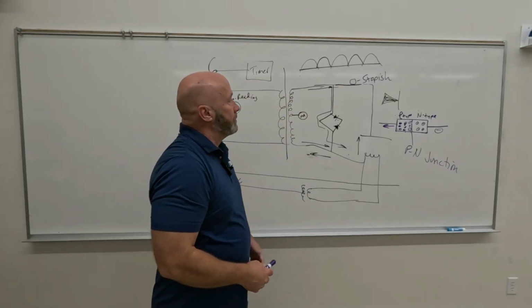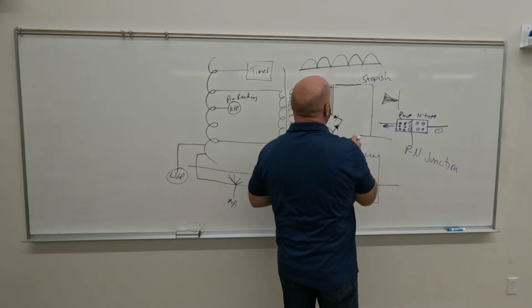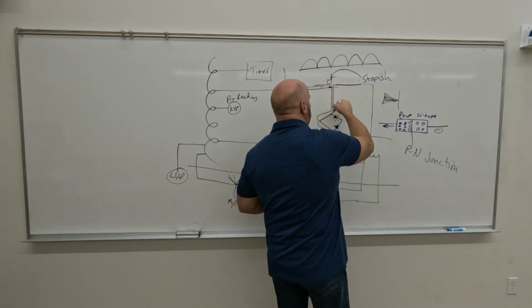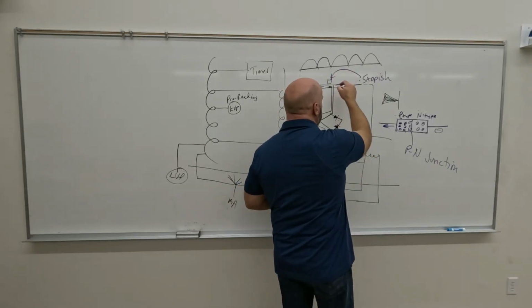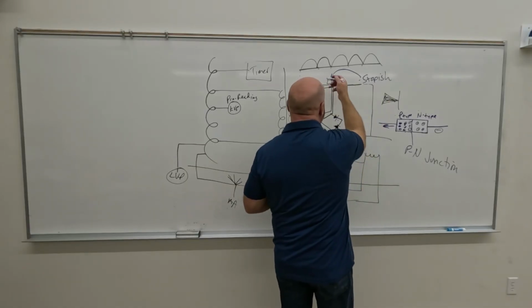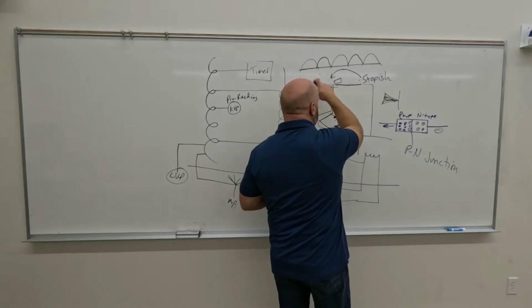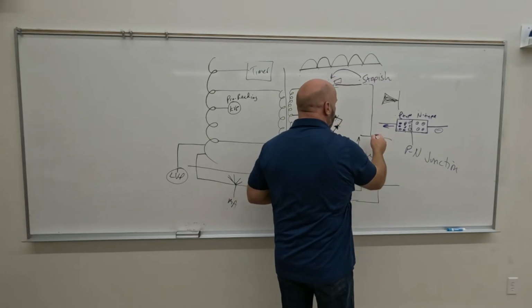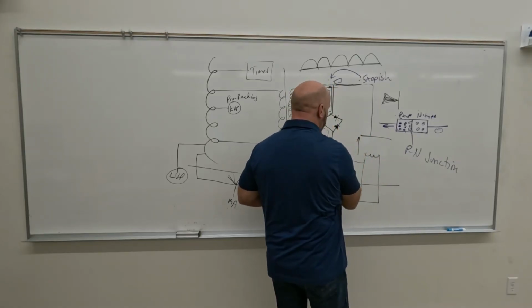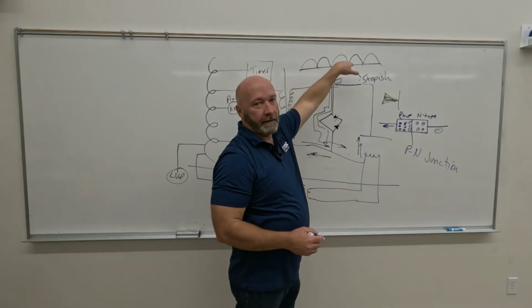Okay, so now instead of having a stop sign there, maybe we'll put our stop sign over here, and we can redirect our electrons through this thing. Then when the electricity is trying to come back in this direction, instead of going to the anode, it will reroute and eventually make its way back down here, so that we've got two pulses going across the X-ray tube, and we're using the full wave.